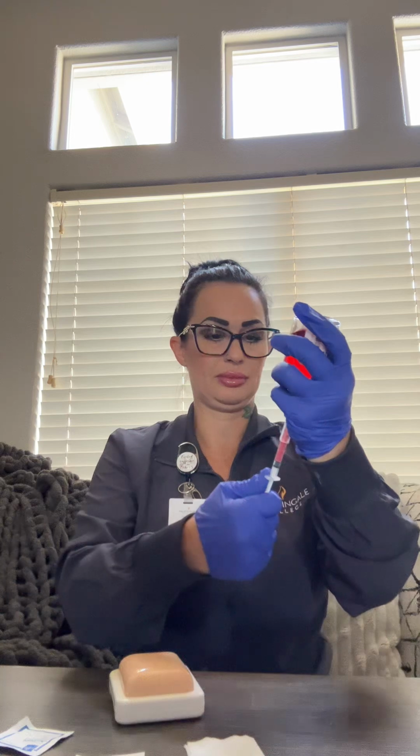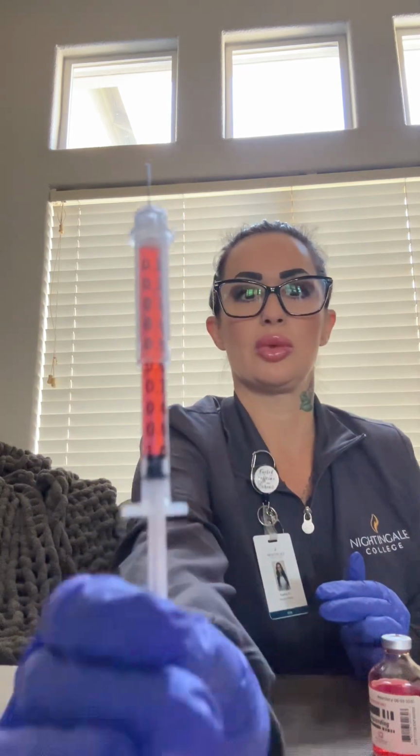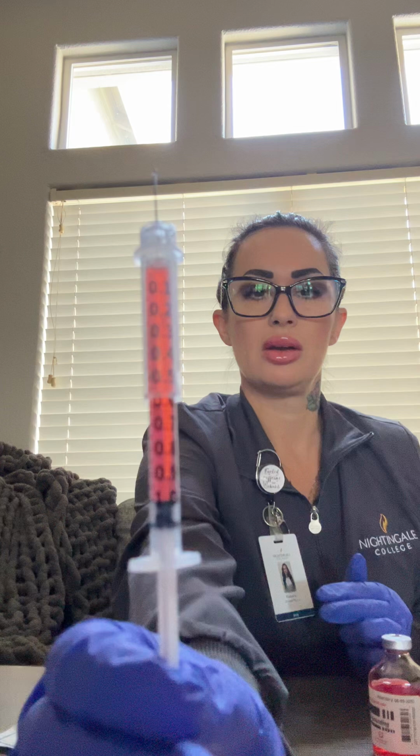Now I'm going to be inverting and drawing up the 1 ml of medication. You also want to make sure that there are no air bubbles, and you'll want to push up on the plunger, if so. There's our 1 ml.